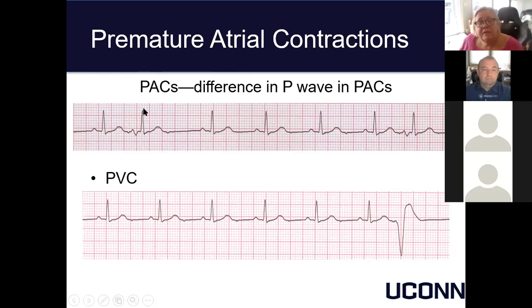The QRS, though, look the same. They have the same morphology. Just like you talk about cell morphology on a biopsy, we talk about conduction morphologies in EKGs. And I bet you this QRS duration is the same as these. Since there is a P wave here, and you can see here, as Eugene was saying, it's not biphasic, but it's half upright, half going down.